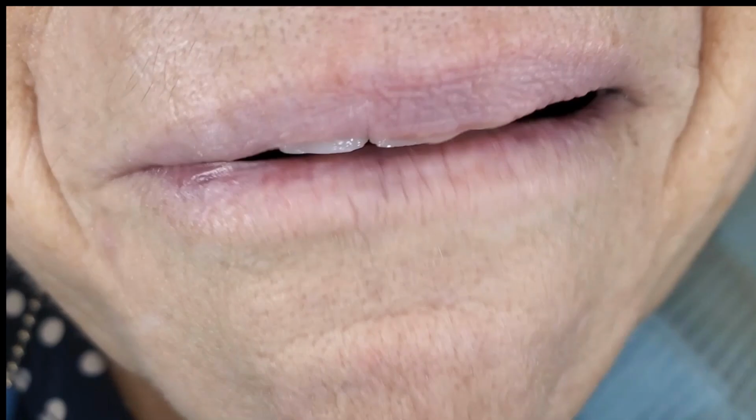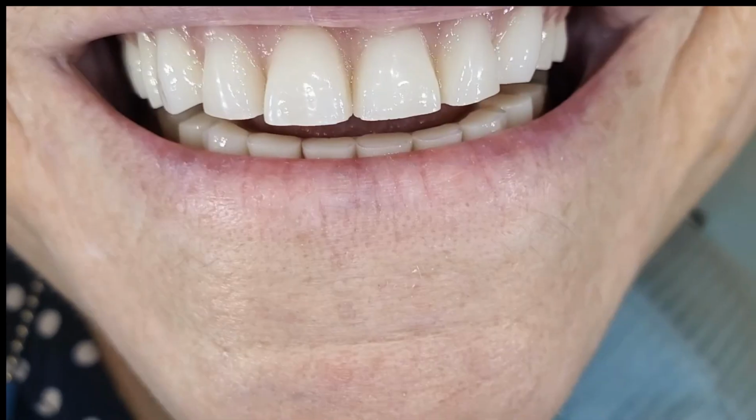Do you see that thing function out to her left? Do you think that's going to go away when I build her new teeth? No, because that's who she is. So when she eats, do you think she's going to function out that way and chew on her left side more? Yep. So I've identified now that when I build this denture, I need to clear everything out for her to function over there.